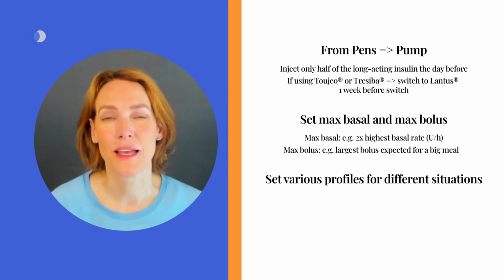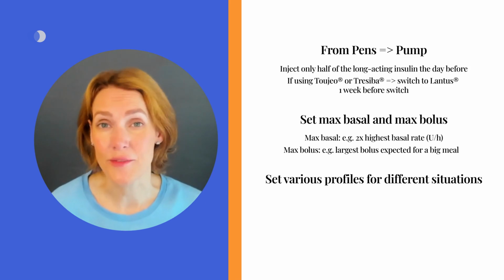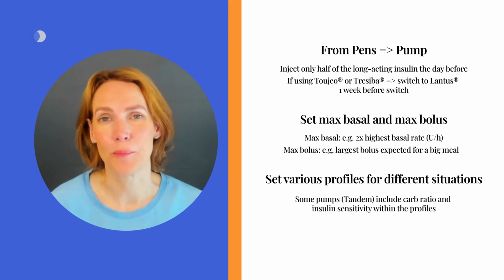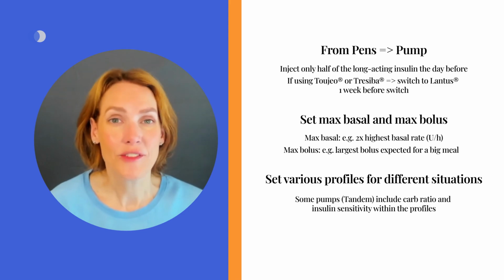All insulin pumps allow users to set various profiles for different situations. The number of basal profiles that can be set varies depending on the pump. Some pumps only store the basal insulin in a profile, while others, like the Tandem pumps, also allow adjustment of the carbohydrate ratio and insulin sensitivity per profile.